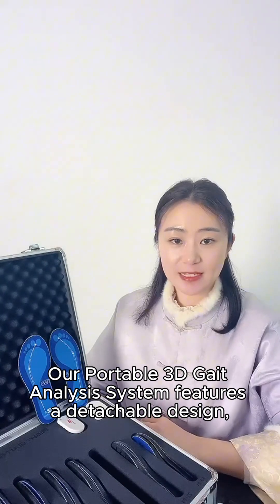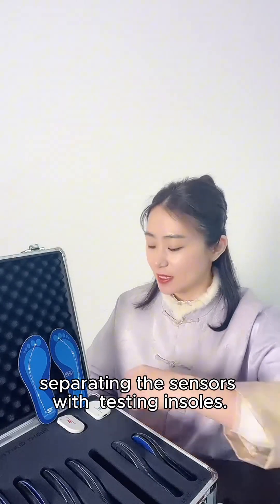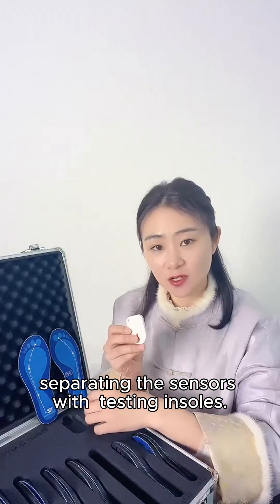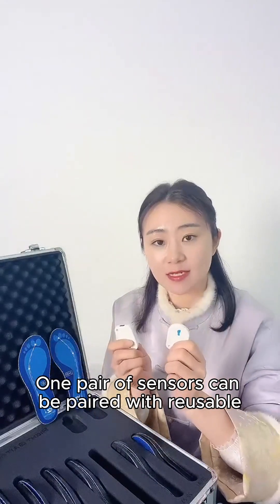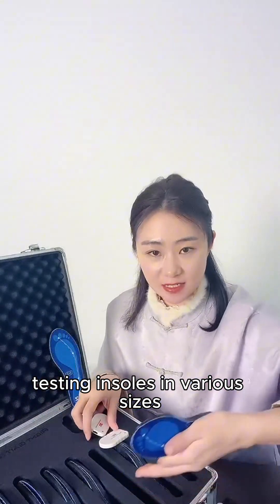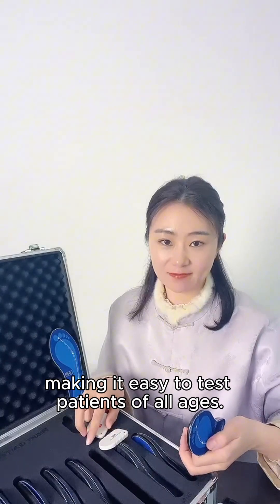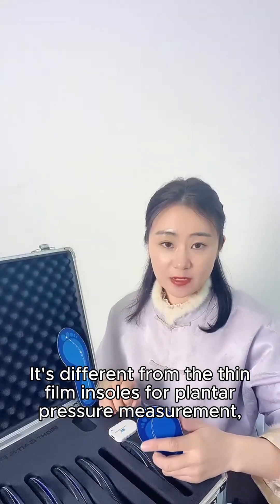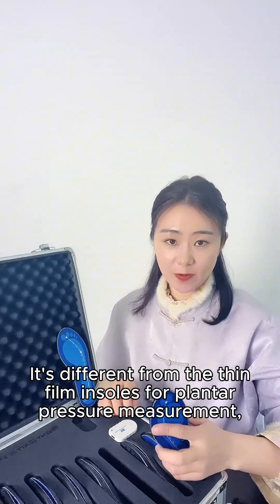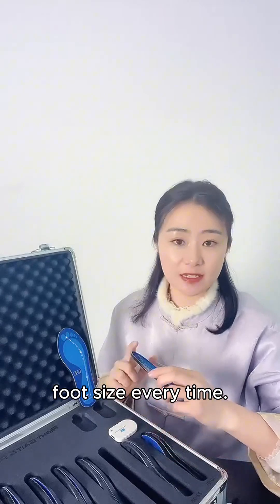Our portable 3D gait analysis system features a detachable design, separating the sensors from the testing insoles. One pair of sensors can be paired with reusable testing insoles in various sizes, making it easy to test patients of all ages. This is different from thin film insoles for plantar pressure measurement, which need to be cut according to the tester's foot size every time.